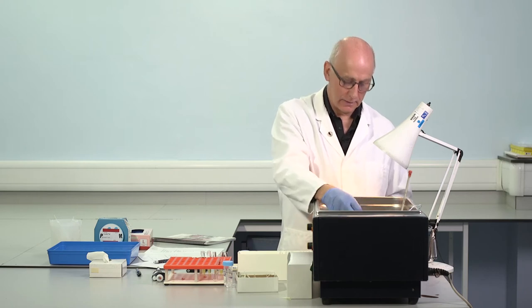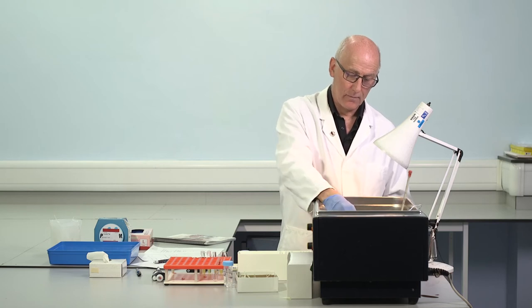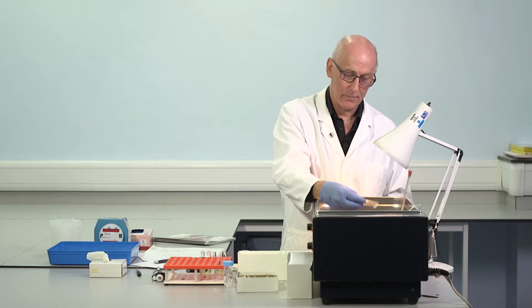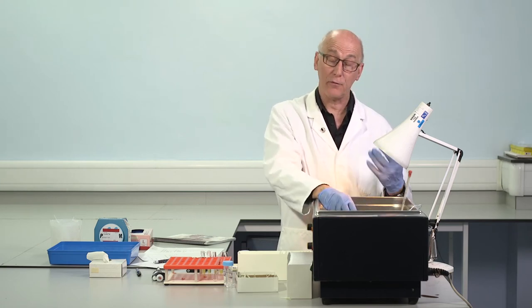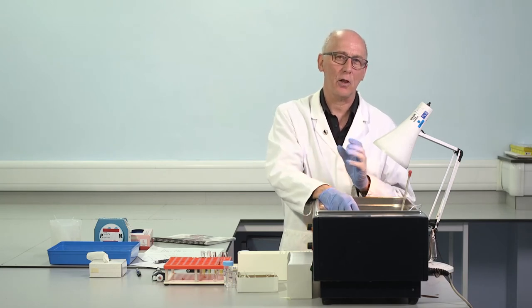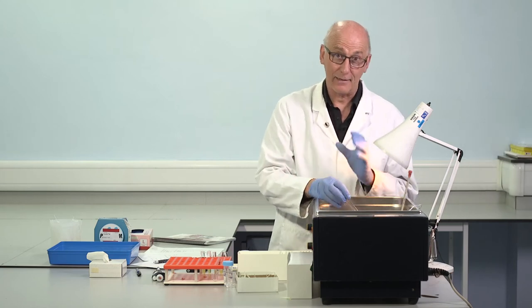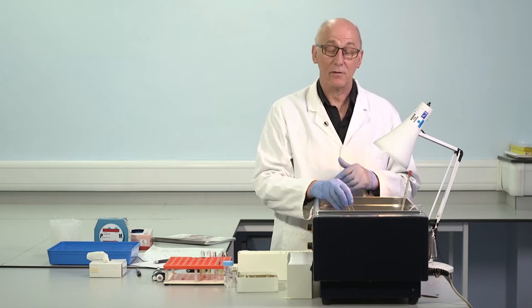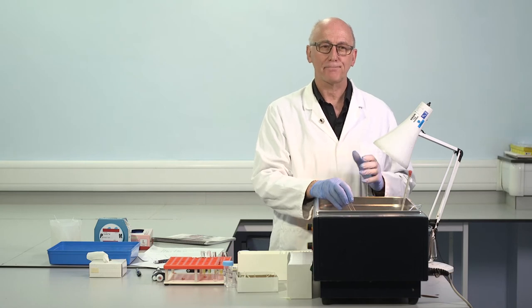It needs to be used in conjunction with the patient's history, an absolutely key part to make decisions about if a result lies outside the reference range, how important is that? That's got to be put alongside the patient's status, history, and so on. And that clinical interpretation is absolutely key. So the normal range is a guide. It's important to have it properly assessed. For APTT, should be done locally.